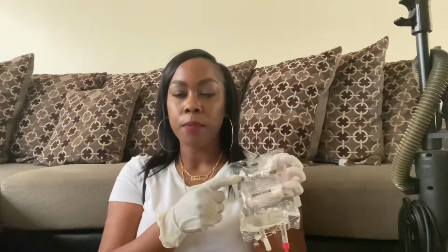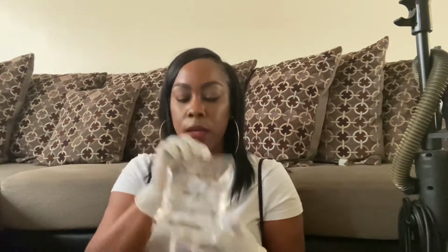This is normal saline right here. Before you do anything, it depends on the facility, but you do want to label your medication, even if it's normal saline. Usually at the facility that we work at, they label it with the date and the time, and below it the date and time that you're going to discard it, and you have to put your initials on there. That's just our facility, but I just want to put that out there.